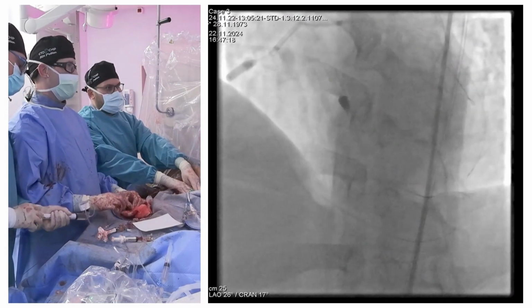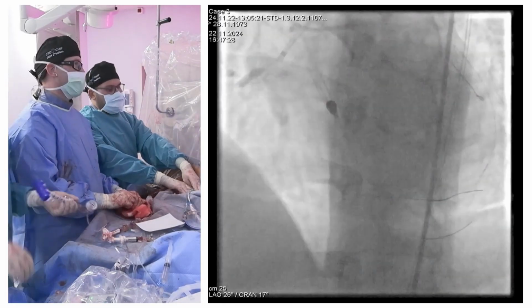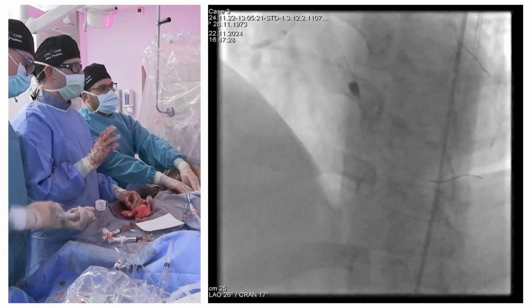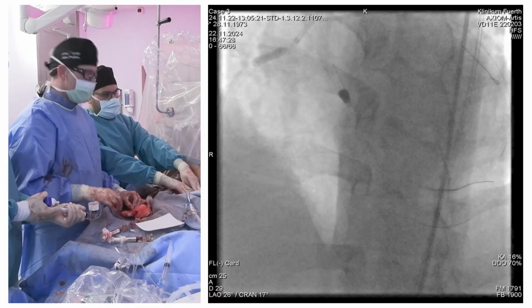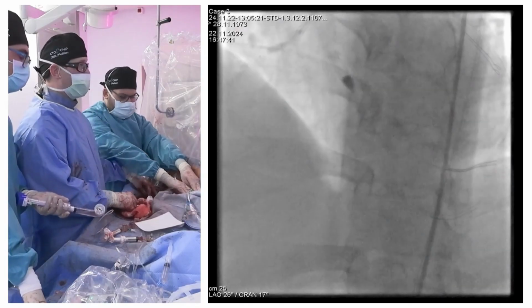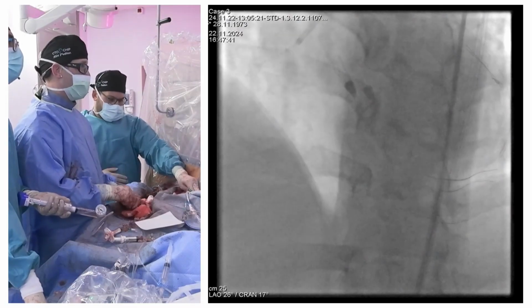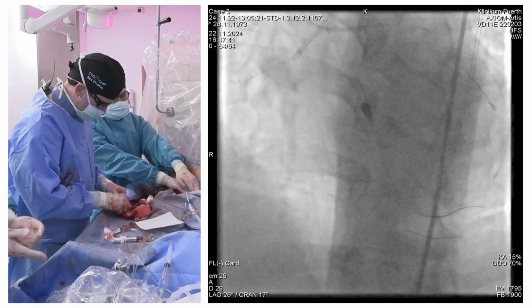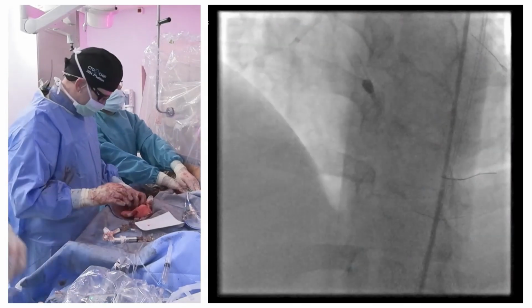Yes, definitely. And you know, we are here with 5.0 in the proximal RCA. We have dilated the whole stent of the RCA to the bifurcation with 4.0. And I think that's what we all have learned in the past. Now the vessels seem to be bigger than we have been thought before, and this is the strength of IVUS, and we are seeing actually how big a vessel is.